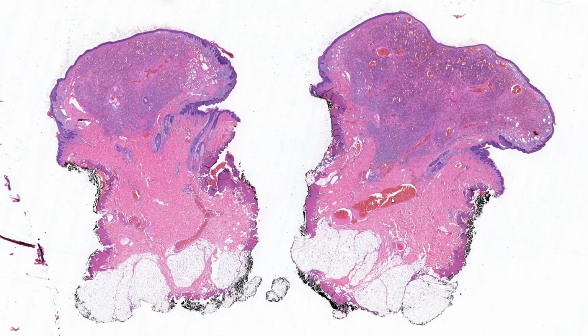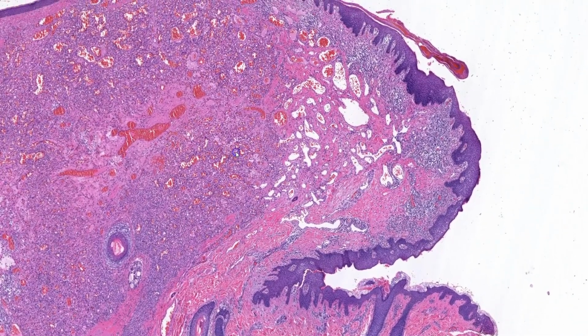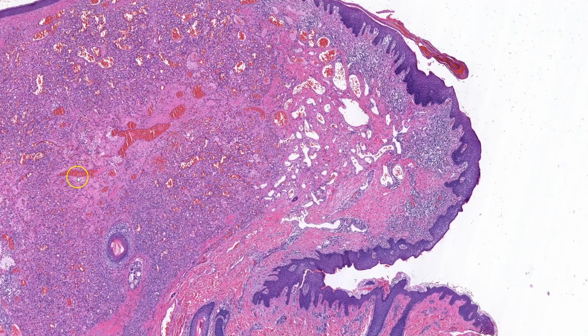The tumor itself appears to contain numerous blood-filled spaces of varying sizes. These may be blood vessels or pseudocysts. Moving to medium power, I can confirm that these are indeed blood vessels. We have larger ones in the center of the lesion, and around them are numerous capillaries. Some are small, while others are larger and more dilated.